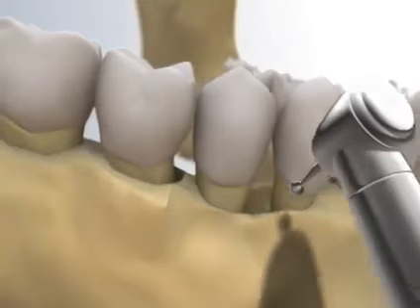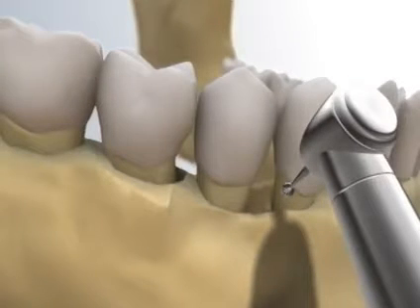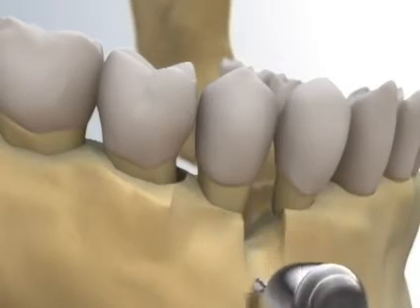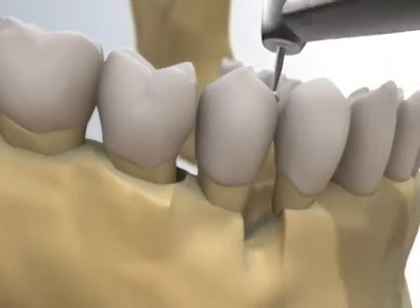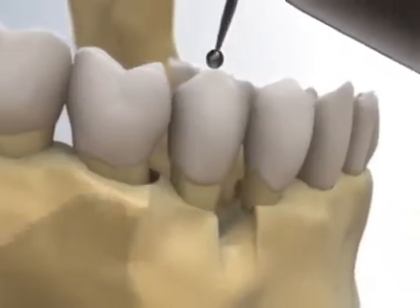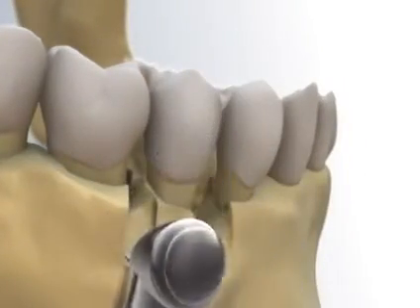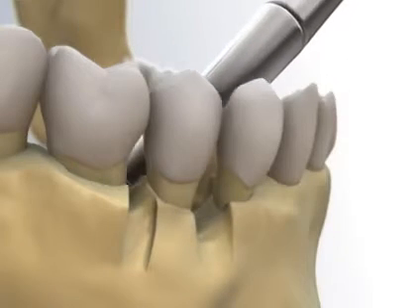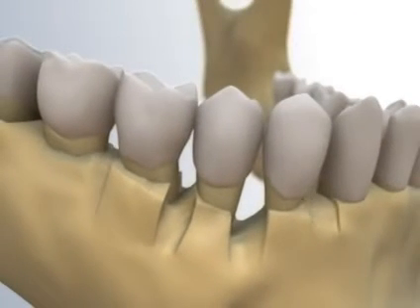With a long-shanked carbide burr, or a number 4 or 6 diamond high-speed surgical burr under sterile saline irrigation, reduce and reshape the interradicular bone. The buccal and lingual bones are removed between teeth 4-4 and 4-5. The floor of the interproximal crater will become the height of the newly created osseous septum.